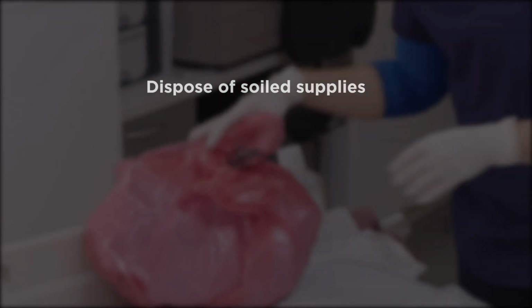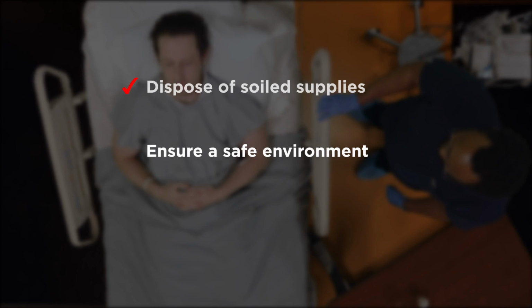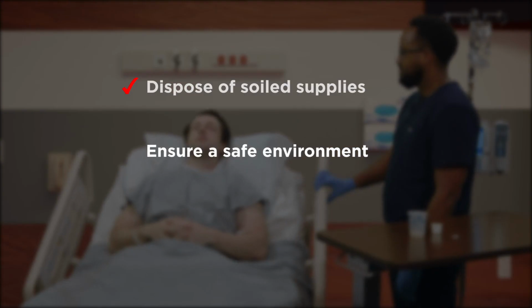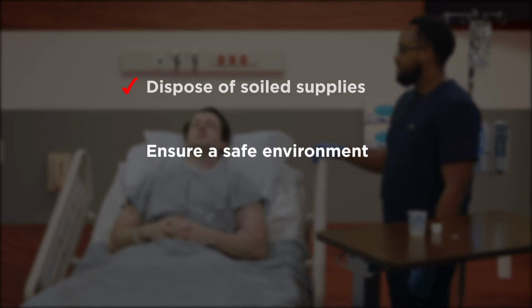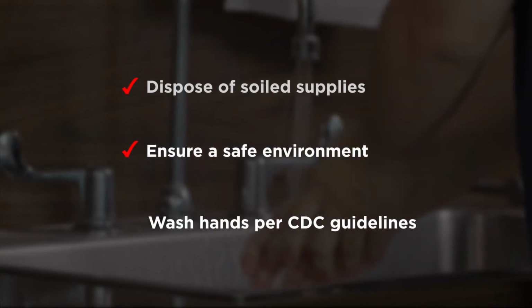Dispose of soiled supplies. Ensure a safe environment, returning bed to appropriate height with brakes locked, appropriate side rails up, and call light within reach. Wash hands per CDC guidelines.